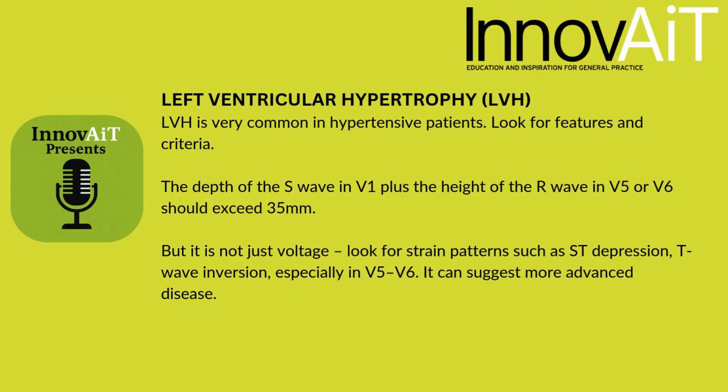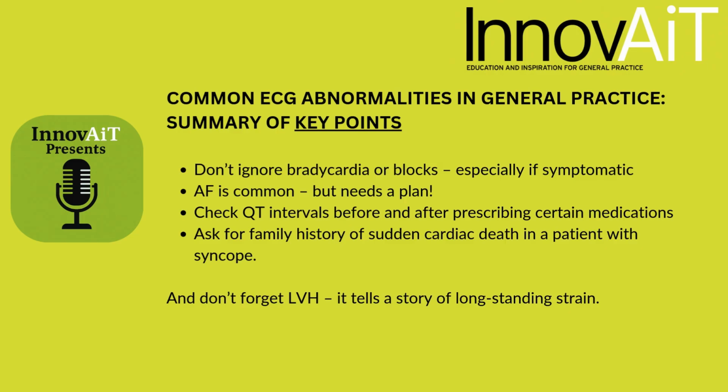Before we go, there are take-home messages. Don't ignore bradycardia or blocks, especially if symptomatic. AF is common, but needs a plan. Check QT interval before and after prescribing certain medications. Ask for family history of sudden cardiac death in patients with syncope. And finally, don't forget left ventricular hypertrophy. It tells a story of long-standing strain.